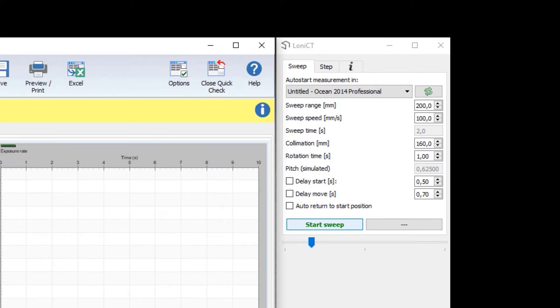The speed of the sweep is set at 100 mm per second. This, together with the tube rotation time, gives a simulated pitch of 0.625.